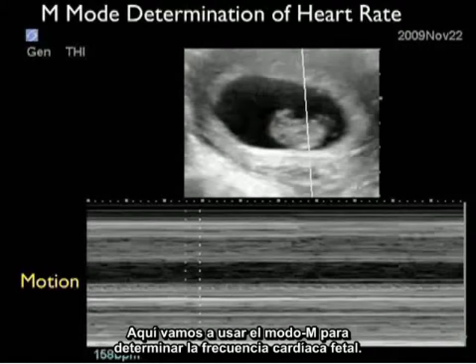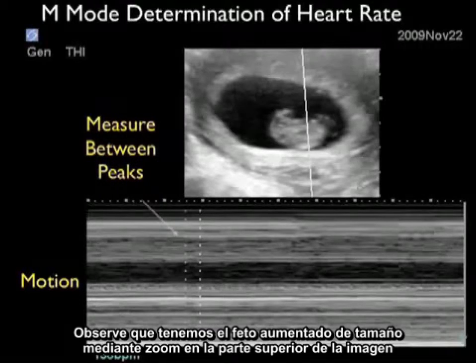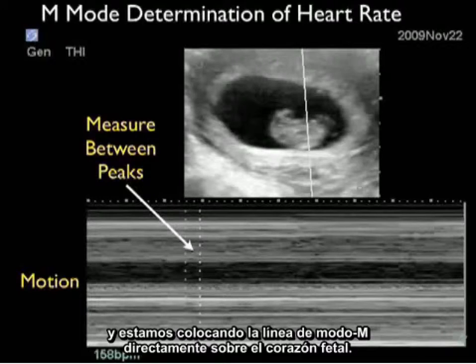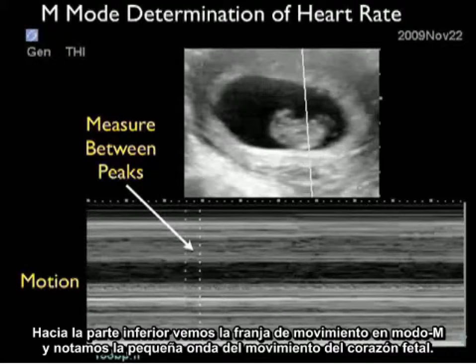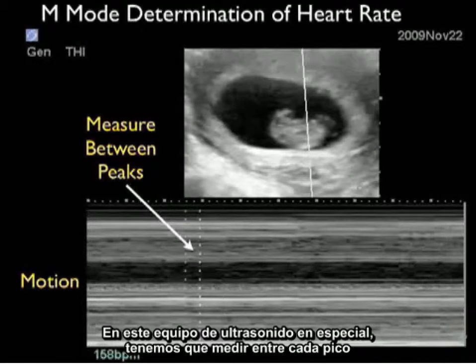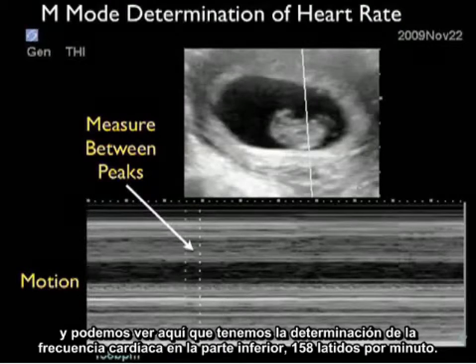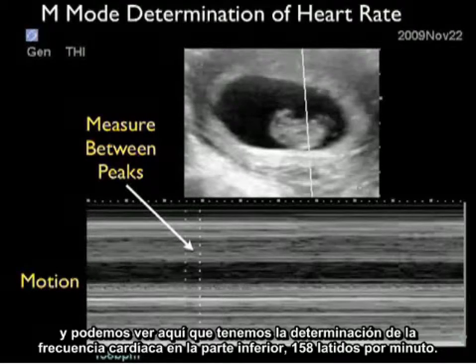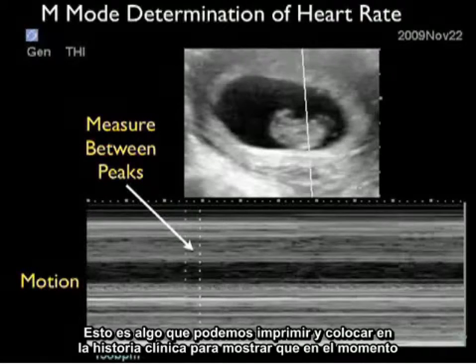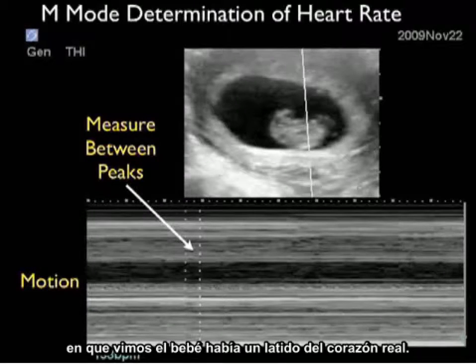Here, we're going to use M-mode to determine the fetal heart rate. Notice we have the fetus zoomed up towards the top of the image, and we're placing the M-mode caliper directly over the fetal heart. Towards the bottom, we see the M-mode motion strip with little waves showing the motion of the fetal heart. In this particular ultrasound machine, we measure between each peak, and we get a heart rate determination of 158 beats per minute. This is something we can print out and place on the chart to show that at the time we saw the baby, there was an actual heartbeat.